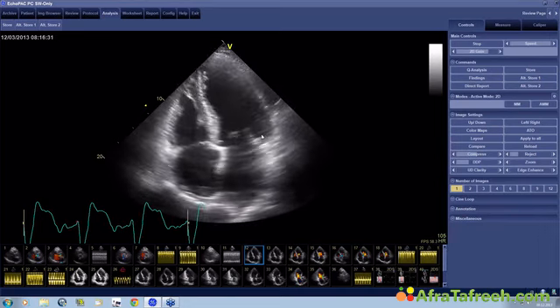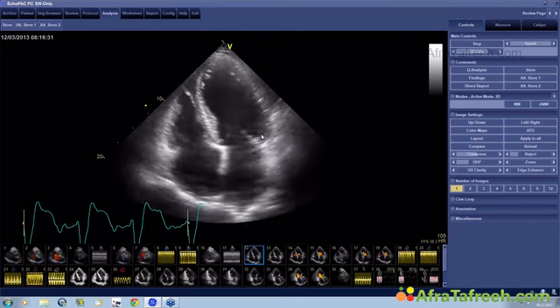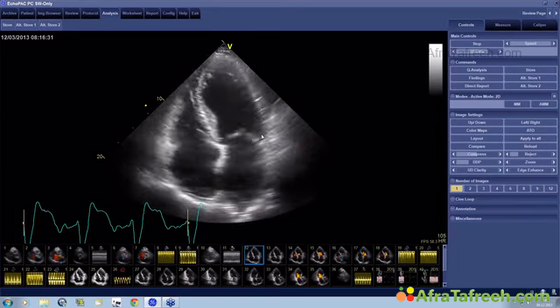So how do we define end diastole, and how do we define end systole? In essence, this is something that is not really possible in patients with this pathology. And what is the pathology? Does anybody know?